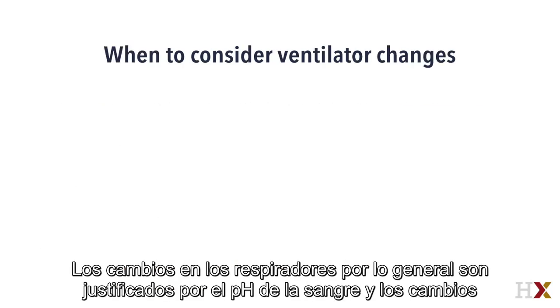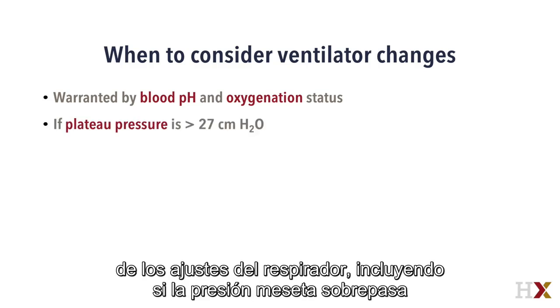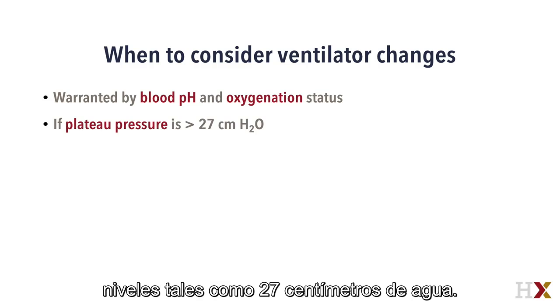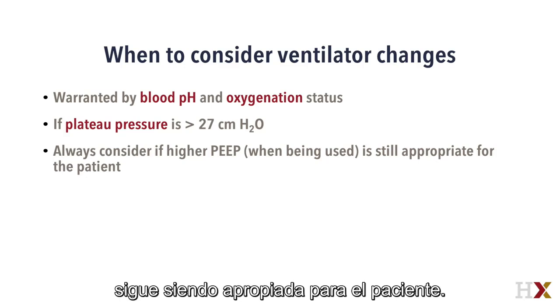Ventilator changes are often warranted by blood gas, pH, and oxygenation status changes. However, some safety measures also will prompt the changing of ventilator settings, including if plateau pressure exceeds levels such as 27 centimeters of water. Always consider if higher PEEP, when being used, is still appropriate for the patient.